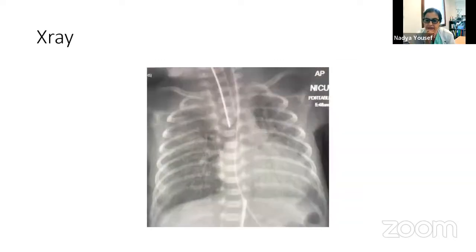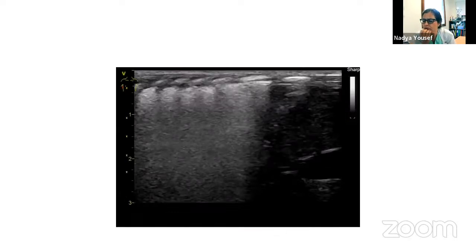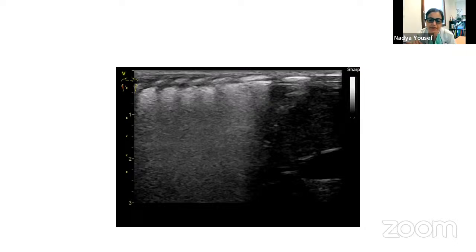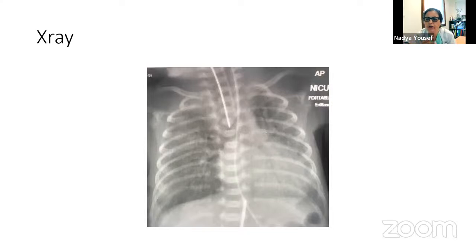So PIE is emphysema, right? Yeah. Pulmonary interstitial emphysema. So I don't have much experience on that because I don't see it much. But what would you expect to see in emphysema? A bit of wet lung, small cystic areas. And what are you seeing on the X-ray? Like here on the X-ray, I could see some cystic areas that are air-filled, right? Air-filled, yes. We're looking for air.